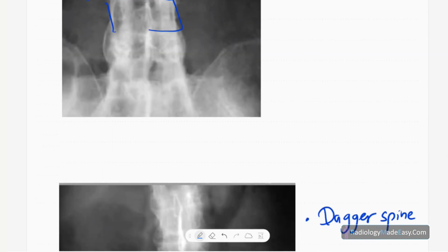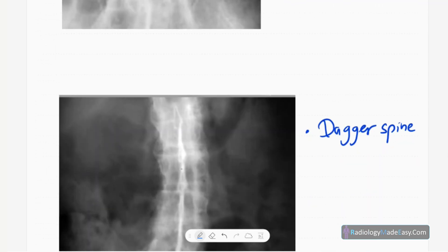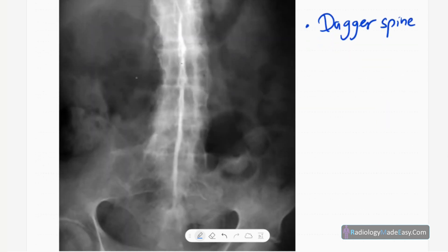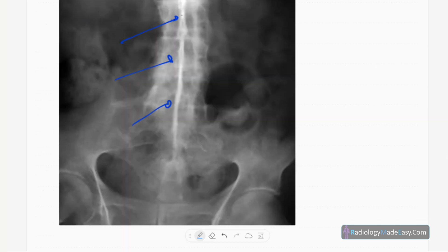Another feature is fusion of the vertebral bodies along with ossification of the interspinous ligament, appearing as dagger spine. You can see a hyperdense line in the center of the vertebral bodies, representing ossification of the interspinous ligament.